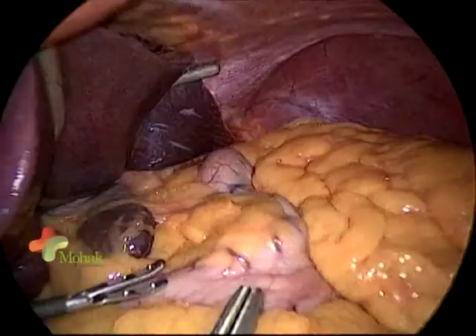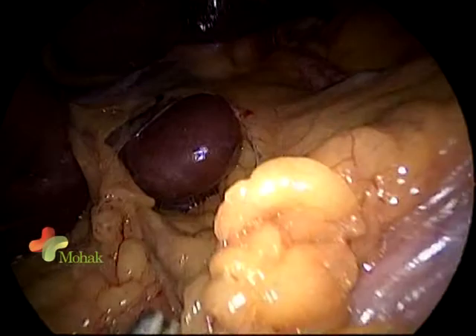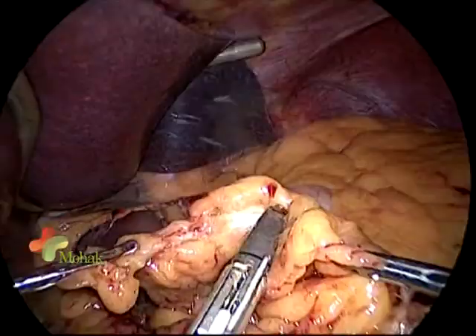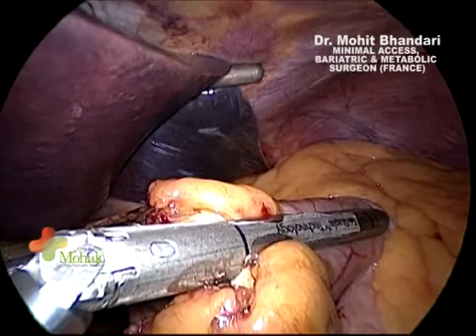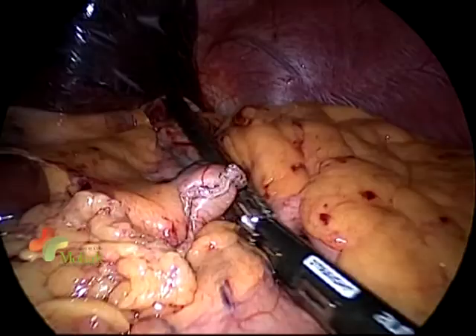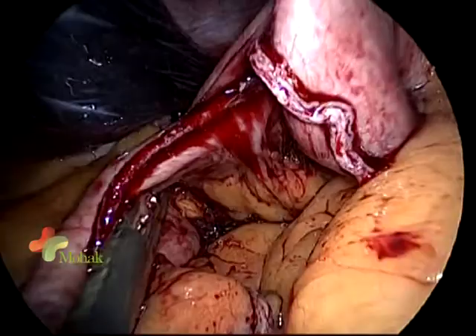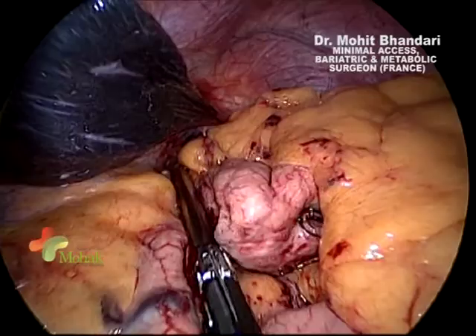We will divide the thick pad of greater omentum to avoid tension over our limb, going close to the base of the transverse colon and dividing under vision. For the pouch, I use the pars flaccida technique: open the pars flaccida, search for the pancreas, enter the lesser sac through the thin flimsy layer over the pancreas, and divide the gastric veins. Then fire a horizontal purple tri-staple cartridge for the horizontal fire. We use a gold finger to dissect and then insert our cartridge.